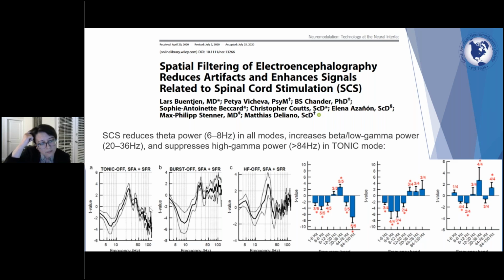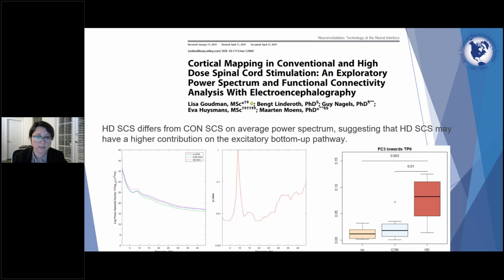Well, this study doesn't cover these changes related to cortical regions, but it proposes that this reduced activity in theta alpha band is consistent with the thalamocortical dysrhythmia hypothesis of pain, which is kind of indicating the enhanced inhibition in the afferent pathway, switching to permanent burst mode, generating slow oscillations in this frequency range. The second study is from 2019.